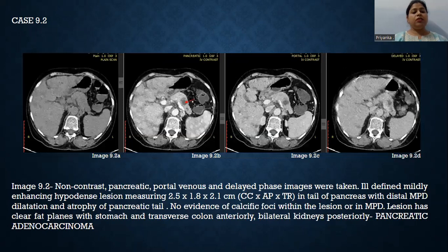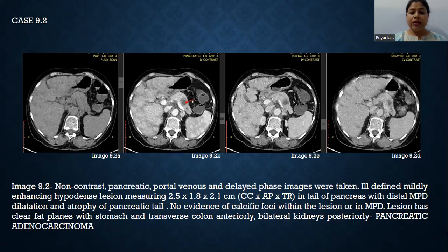This is another case of pancreatic adenocarcinoma. There is an ill-defined, mildly enhancing hypodense lesion in the tail of the pancreas with distal MPD dilatation and atrophy of the pancreatic tail. There is no evidence of calcific foci within the lesion or in the MPD. The lesion has a clear fat plane with the stomach and transverse colon anteriorly and bilateral kidneys posteriorly.